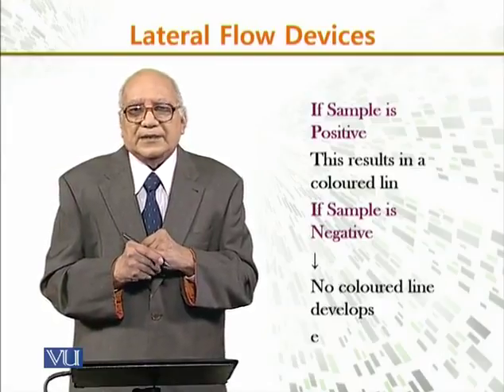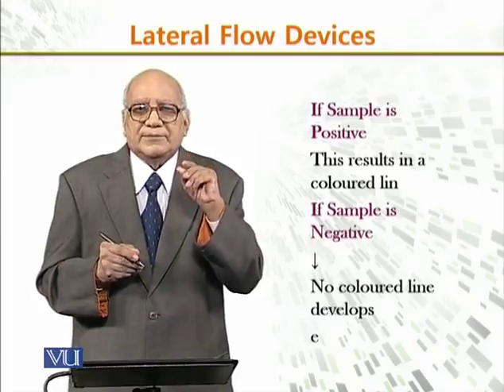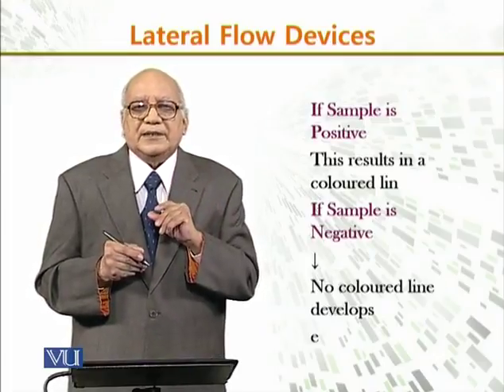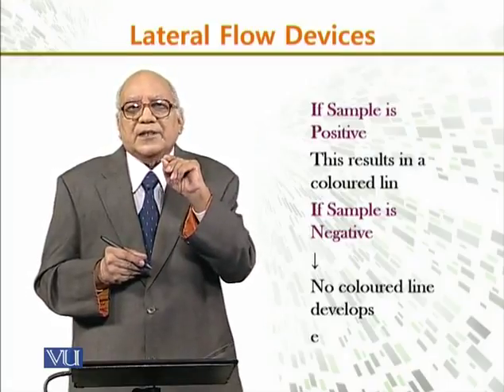If a positive antigen is present, the sample gives the colored line.